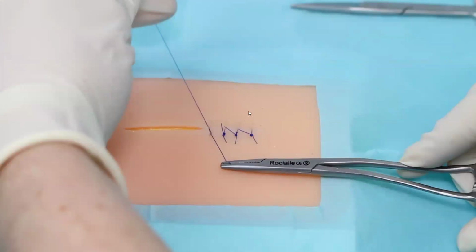So this lateral edge or the other edge, it's up to you. What if you make the tie in the center of the wound? No problem. You can hold the head of the tie with the needle holder and push it to the lateral edge. Easy? Yes, sir. Okay, then do the second one. Only 2 sutures. Don't make more.